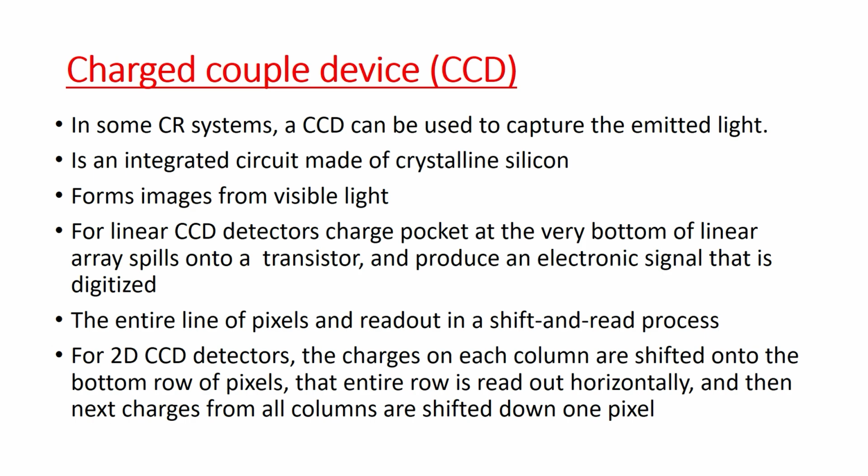For a linear charged coupled device, the charge packet at the very bottom of the linear array spills onto the transistor and produces an electronic signal that is digitalized. The entire line of pixels is read out in a shift and read process.